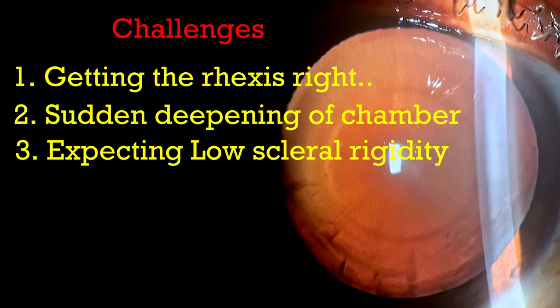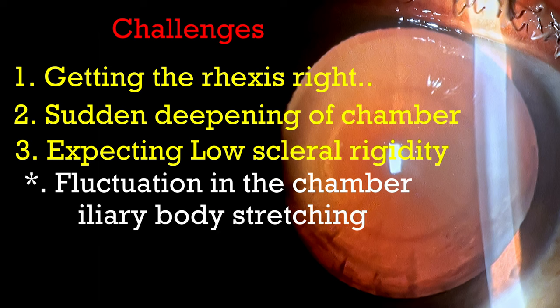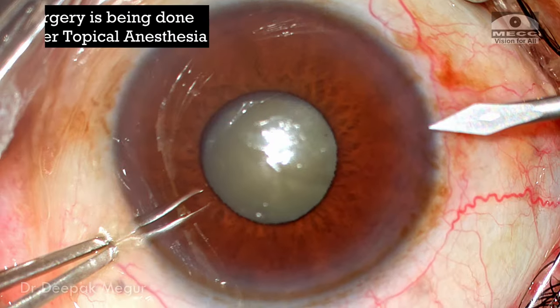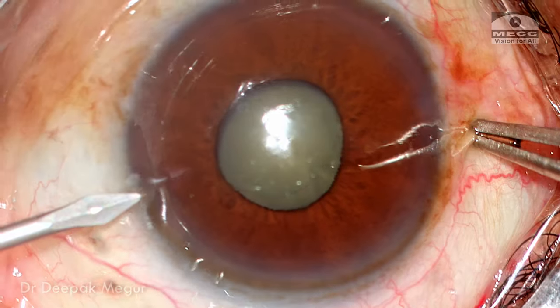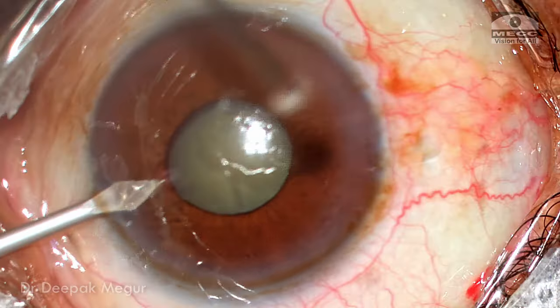This happens because of the low scleral rigidity expected in pathological myopic eyes, due to greater chamber fluctuations compared to a regular patient. There will be some stretch in the ciliary body, which is why the patient will be much more sensitive to pain compared to an average axial length patient. That's also my concern — to have adequate intracameral anesthesia. In these long eyes, I don't want to use any needle peribulbar anesthesia, so I'm going to perform the surgery under topical anesthesia supplemented with intracameral anesthesia, and may use it a couple more times during surgery.